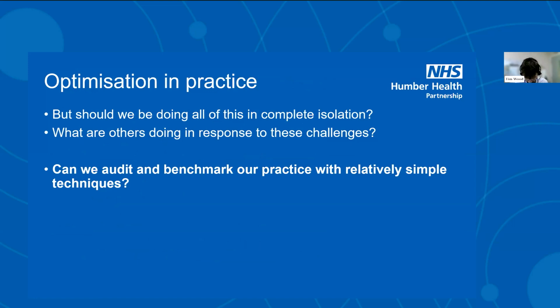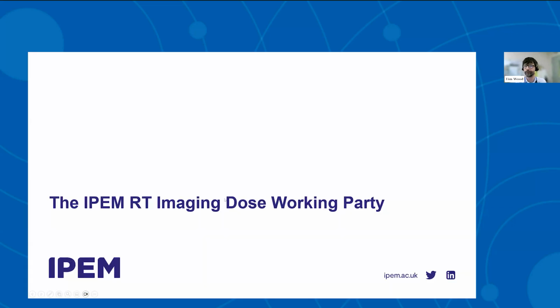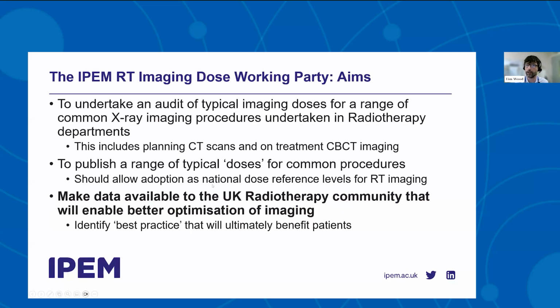Okay. So that's where this idea came from, about auditing and benchmarking practice in different centres across the UK. It spun out of an IPEM scientific meeting, and we established a working party that was going to investigate this. And the idea was to take long-established concepts we've used for many years in the diagnostic field, the idea of dose reference levels, or diagnostic reference levels, and patient dose audits, and we're going to apply it to the radiotherapy scenario.